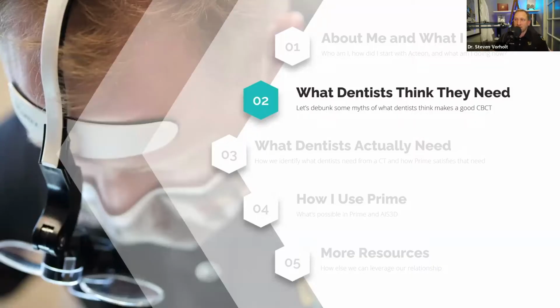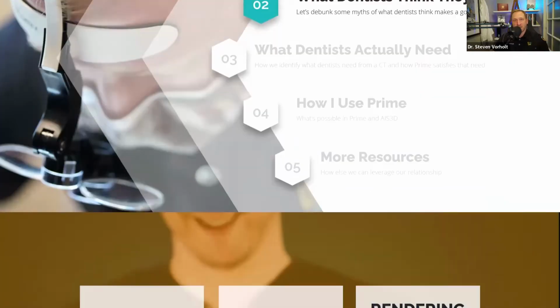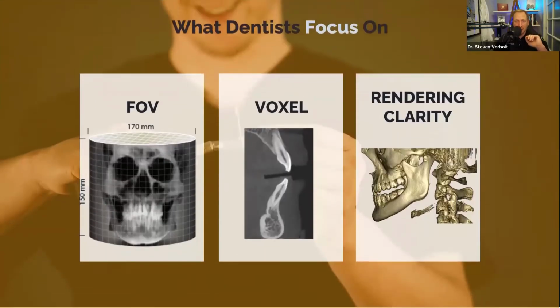So let's talk about what dentists, when they're first looking at CT, think they need in a good CBCT. There are three things that I think most dentists focus on when they're first looking. They think of the field of view: how much can they see? They think of the voxel, which is the pixel, or how tight the image is, like what's the smallest bit of data that they're able to slice through. And then they look at rendering clarity.